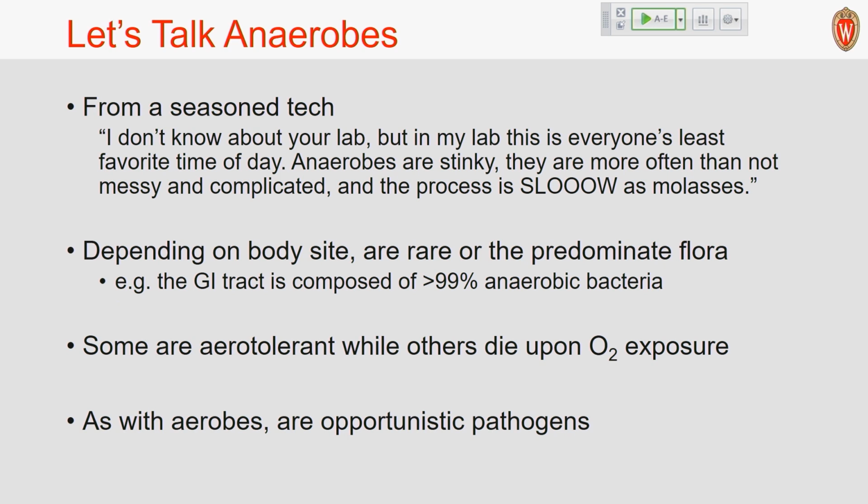Now, anaerobes, okay. I should have put this up there. How many labs do aerobe cultures but not anaerobe? Aerobes, okay. So you would send your anaerobes out to reference labs. From one of my co-contributors: I don't know about your lab, but in my lab, this is everyone's least favorite time of day. They're stinky, they are more often than not messy and complicated, and the process is slow as molasses.